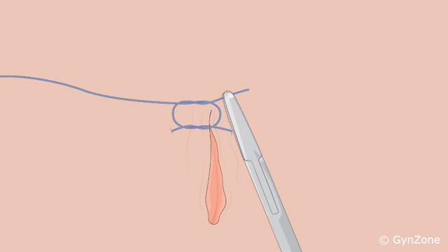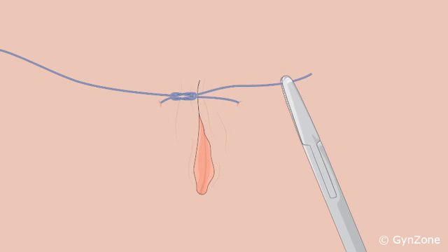This time, the short end of the thread is pulled in the opposite direction of the first throw to tighten the knot. For this reason, you will open your arms when the knot is tightened.